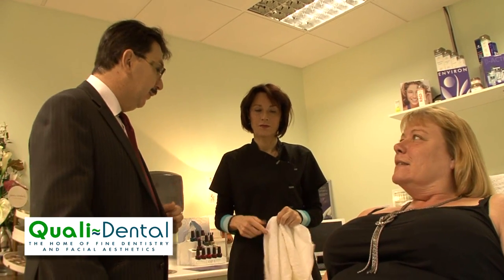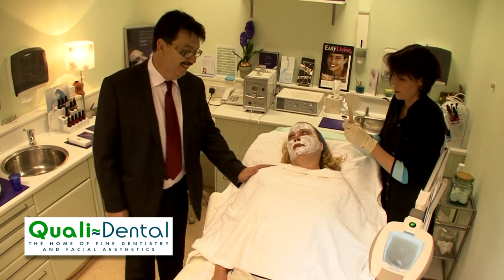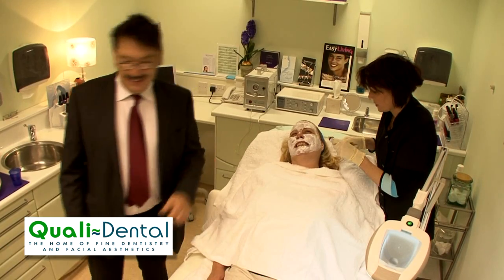Okay? So the process involves anesthetizing the surface of the skin with a lot of Emla cream, which goes on for about 40 minutes before the actual procedure takes place. It is actually a restorative process.